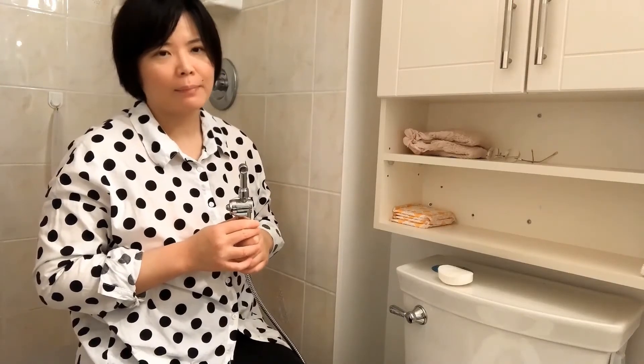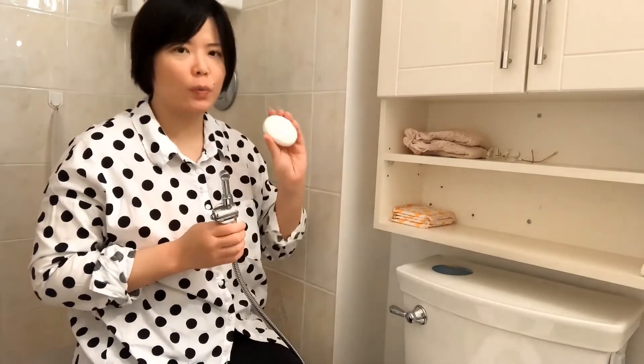We all know that prior to doing IC we have to sanitize our private area. The most common practice is to use something like this with a sanitizing component, but I had somebody with normal sensation test it out, and after just a few uses she felt a little dry. That's okay if you have to go out and have no other means available, but if I'm at home I prefer to use soap with a moisturizing component, which is definitely most friendly to our most delicate area.